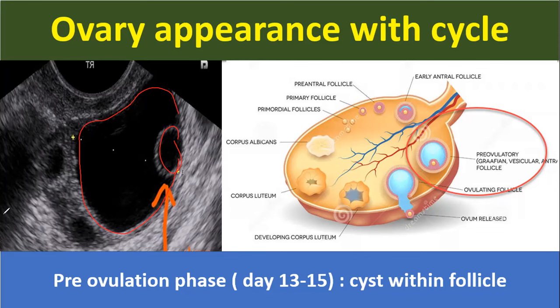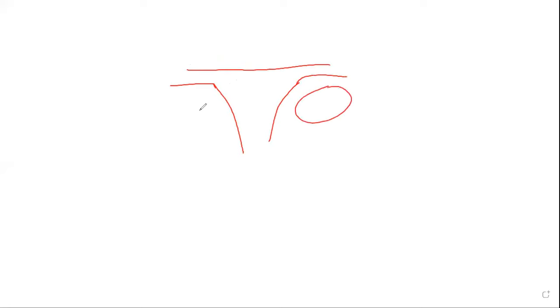And I'll give you a little tip here. You are following up a patient for ovulation, that's to say, folliculometry. And you see in your examination the uterus and the two ovaries, one here and the other here. I see a dominant follicle, or big follicle, and another here. Let's say this is 25 millimeters and this is 16 millimeters. So this seems to be the larger one, so perhaps the ovulation is just about to happen.